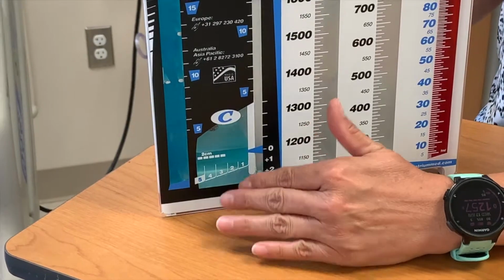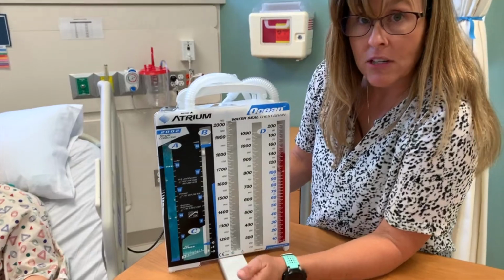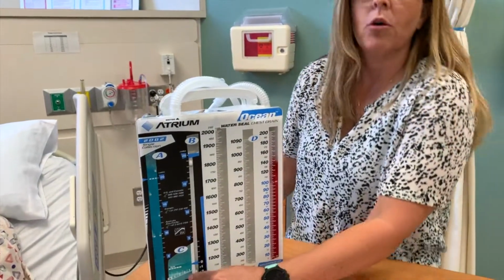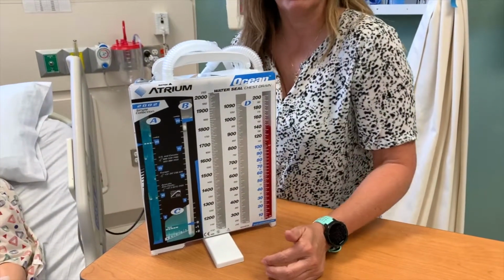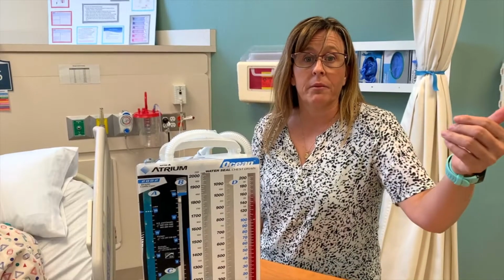Now, as the patient gets better and that pressure begins to normalize back to what it's supposed to be, that will go away. You don't want to see that actual bubbling anymore, all right? All right, so let's go through complications now.